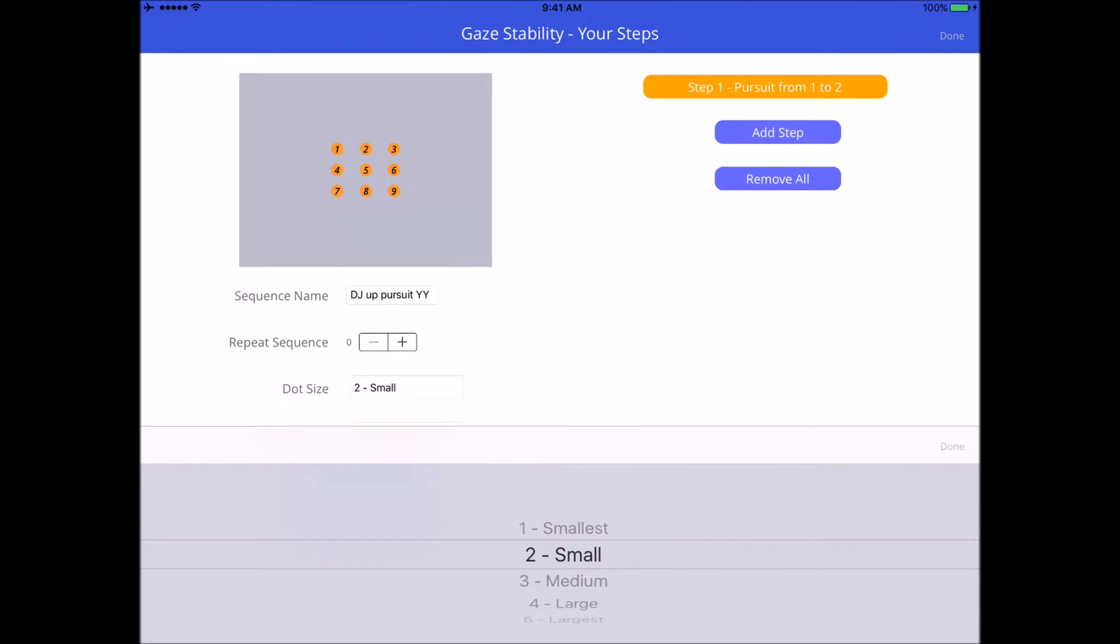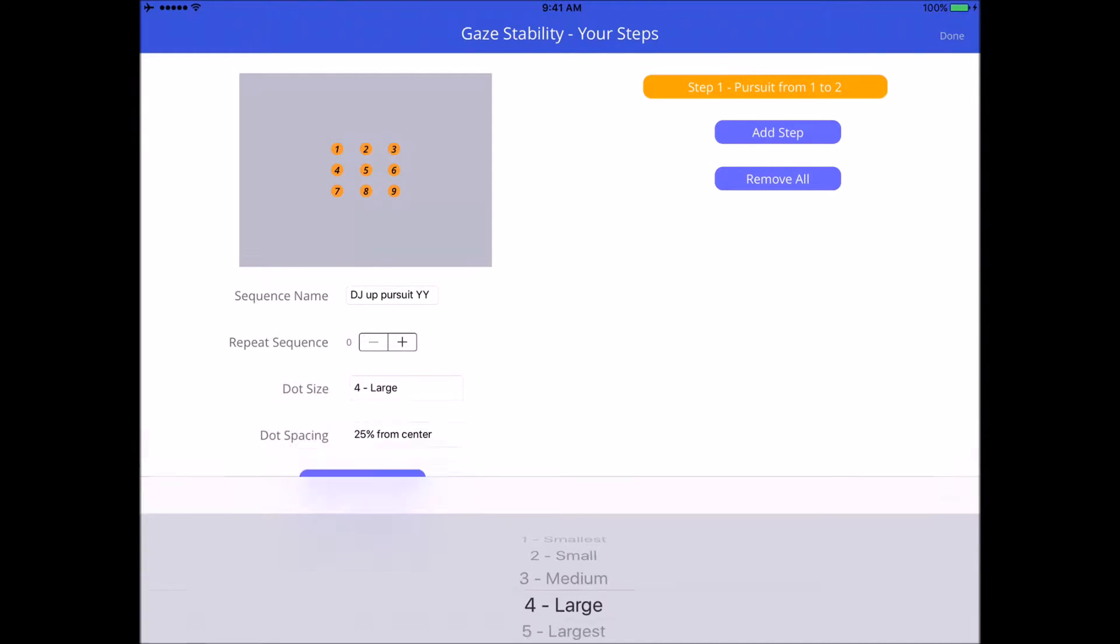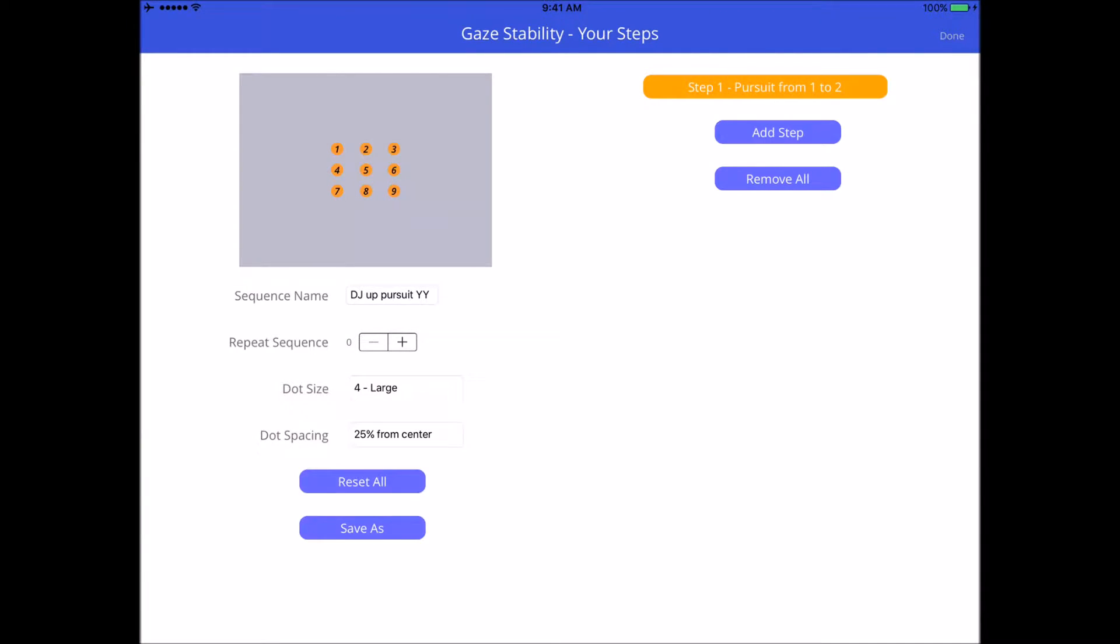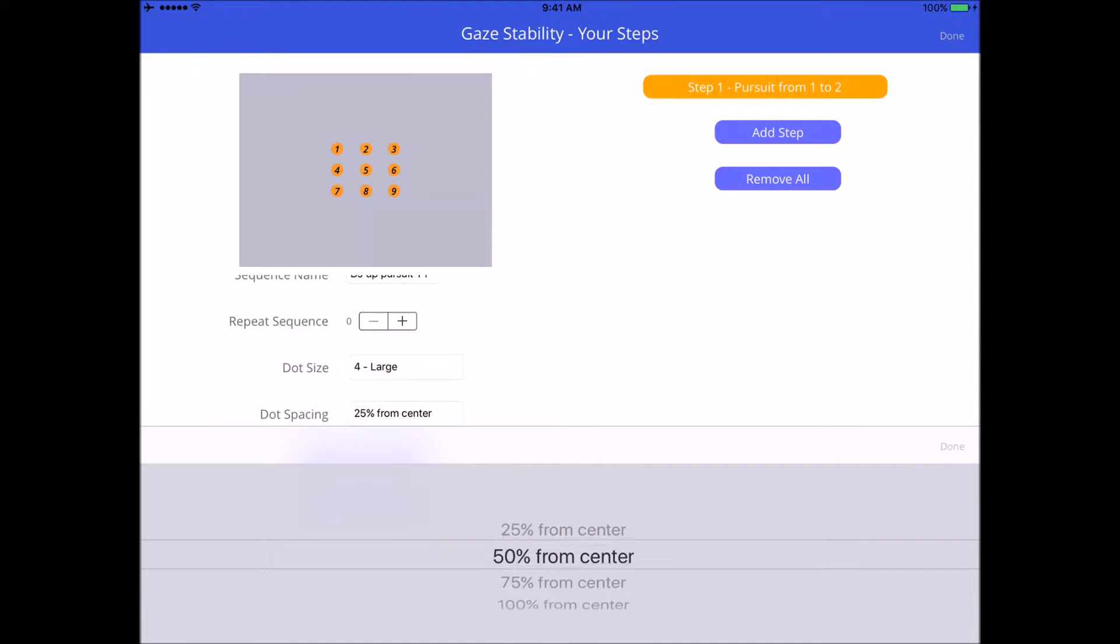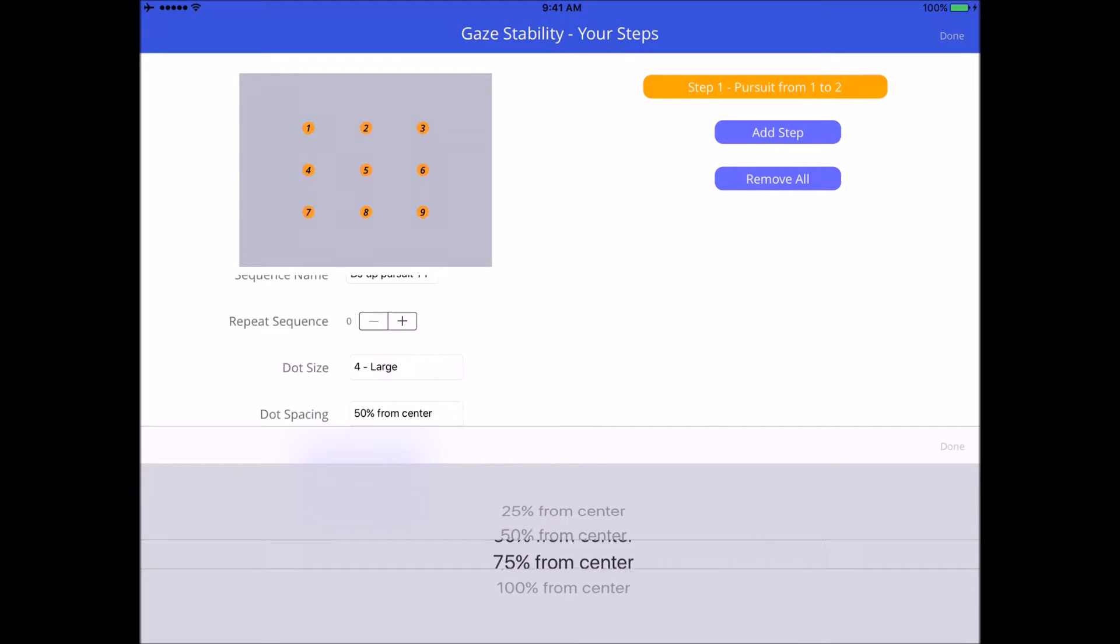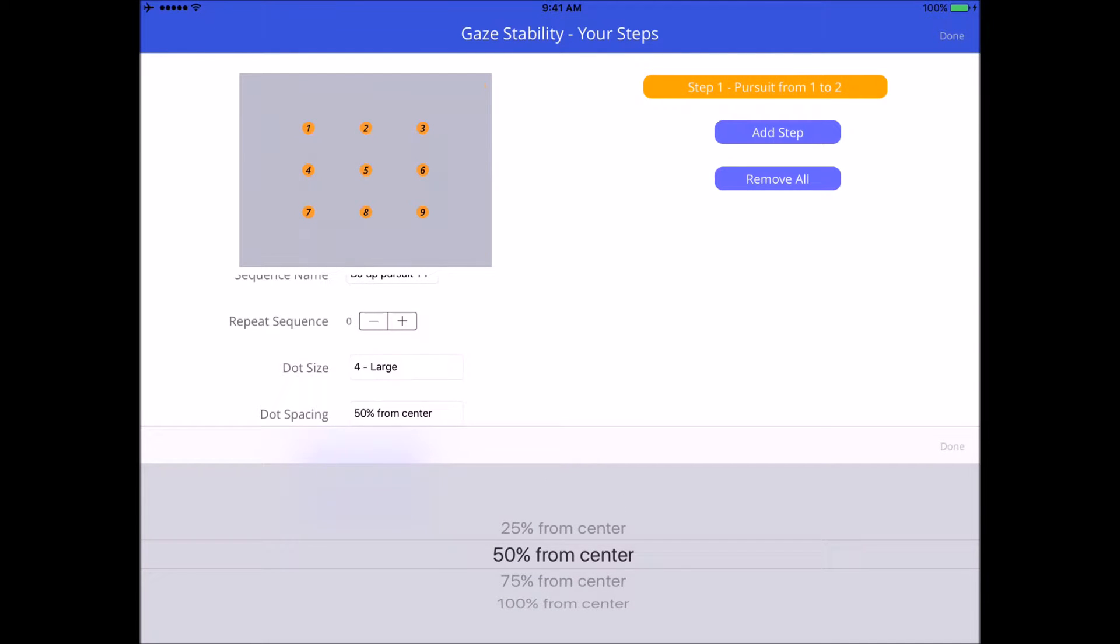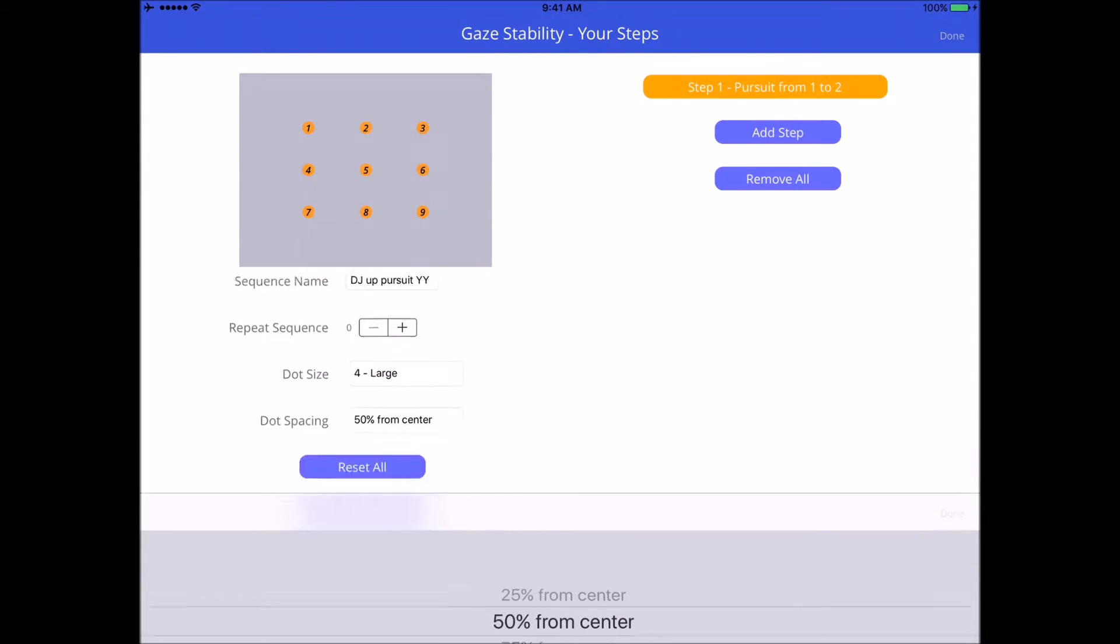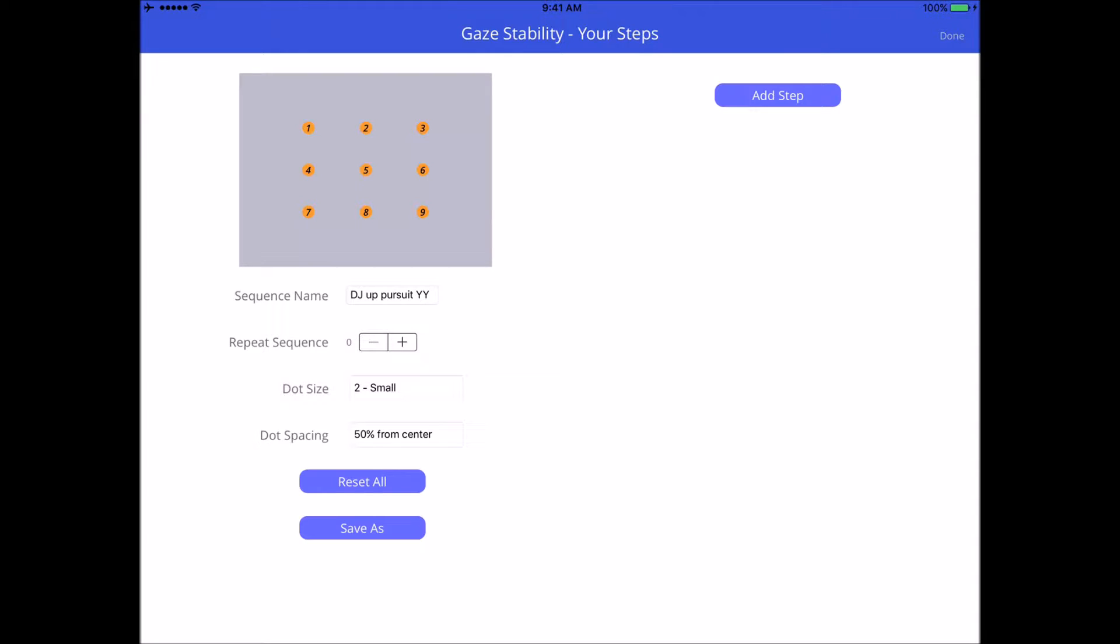The third option on this screen is the size of the target. Let's make it a large size. The spacing, you can actually have your target spaced really close at 25%, 50%, 75%, or 100% just to be all the way out on the outside of the screen. For demonstration purposes we're going to keep it at 50%. You can also reset everything. On the right-hand side I have remove all, which will clear everything, all the steps that I've created before.